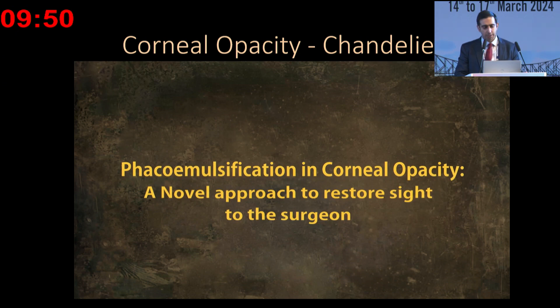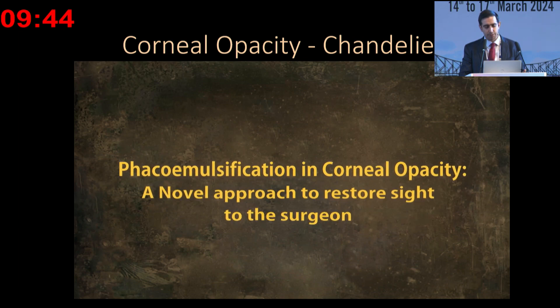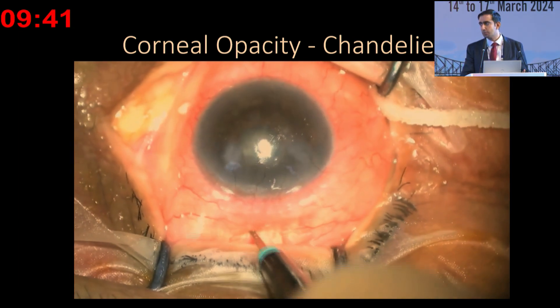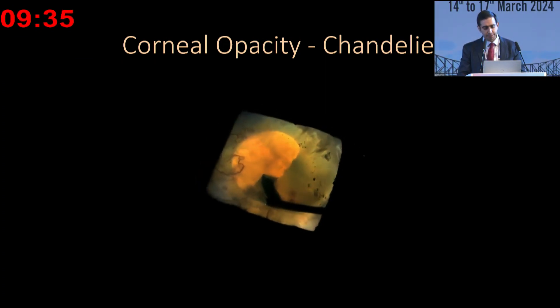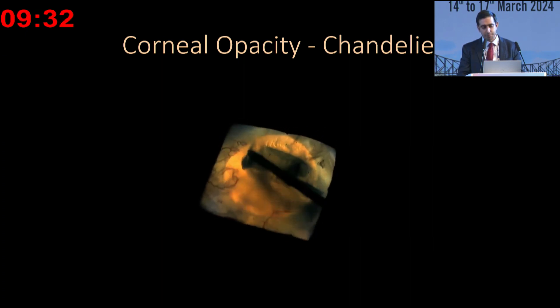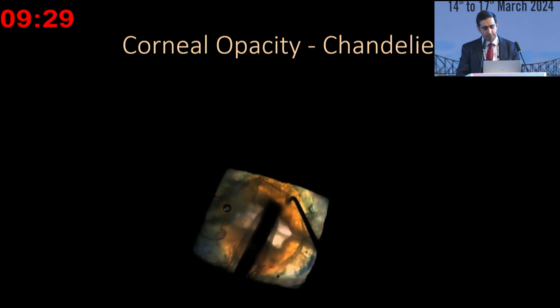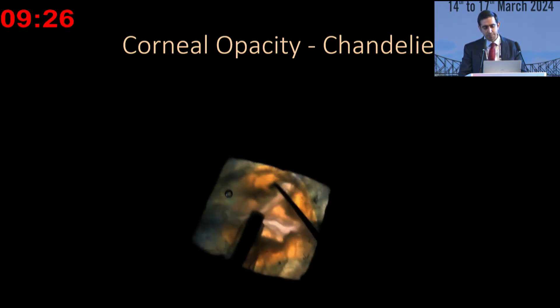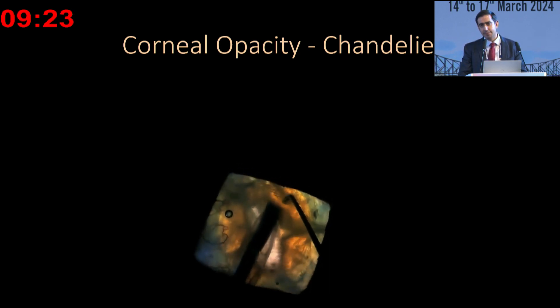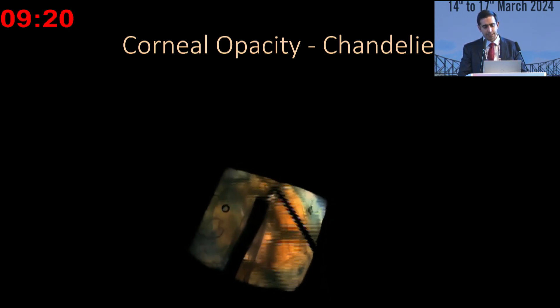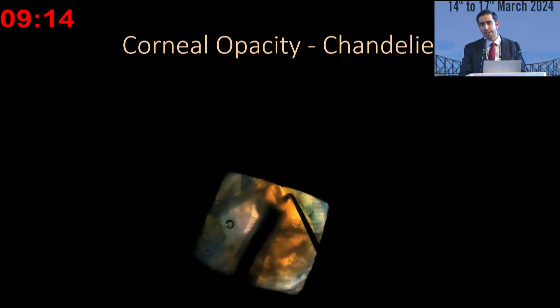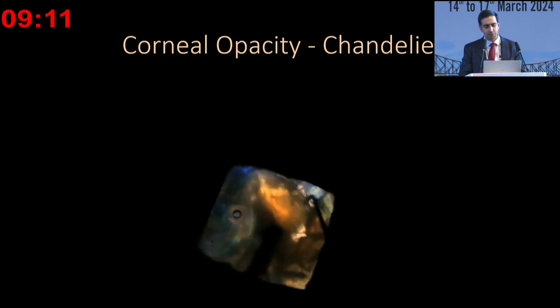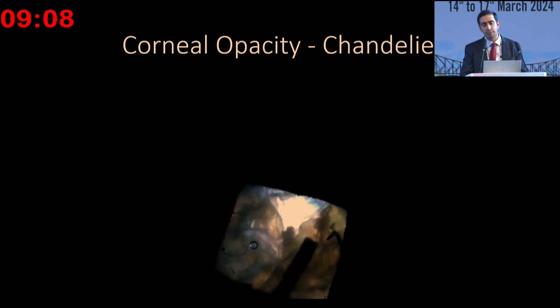The first video I'd like to play is regarding corneal opacities. Very often the visualization is poor in these particular cases, and we've actually resorted to the chandelier technique to help us. You can see the 23-gauge trocar cannula is placed, and as the chandelier comes on, the illumination becomes much better. Generally, you switch off the microscope light, and you can see the phacoemulsification being done here.